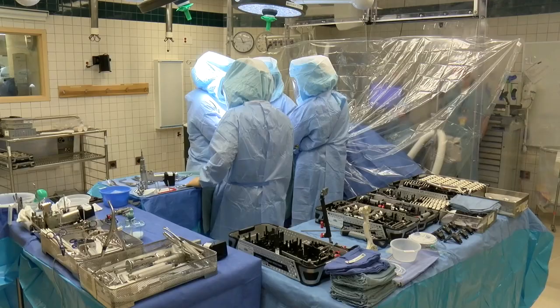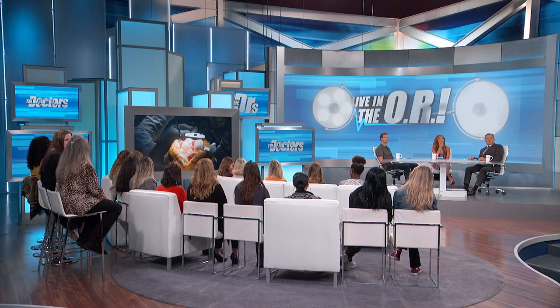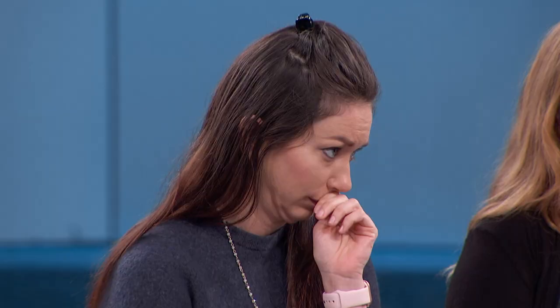These are all what we call bone spurs or osteophytes on the side of the knee, and we'll remove all that as we go. We're getting ready to prepare the end of the femur. This guide goes up into the bone on the end of the femur and sets the amount of bone and the angle that I'm going to cut at, so we can put the implant in the right position.